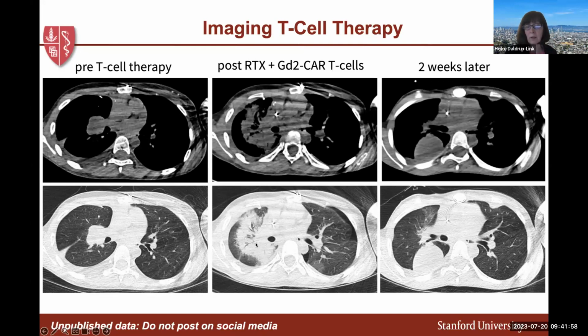So we do believe that the radiation therapy led to an increased accumulation of the cells in and around that lesion. And to our surprise, we got an almost complete response of that lesion at the right hilum. And this is really fascinating because osteosarcomas are very refractory to treatment. And in fact, you see that one of the non-irradiated lesions here grew a lot in the interval. So it seems like the combination of radiation therapy and CAR T cell treatment seems to be very synergistic.